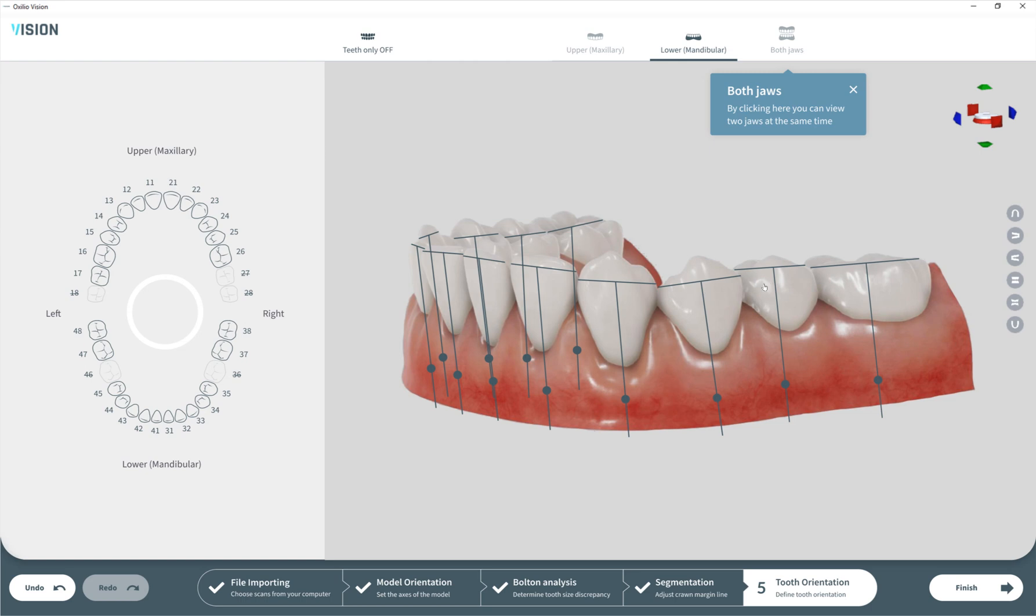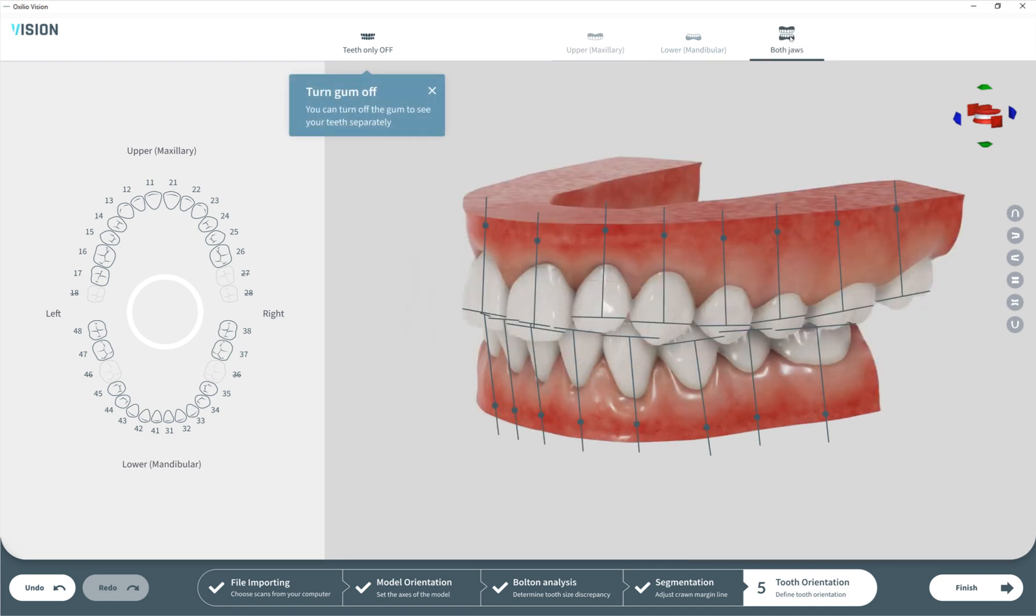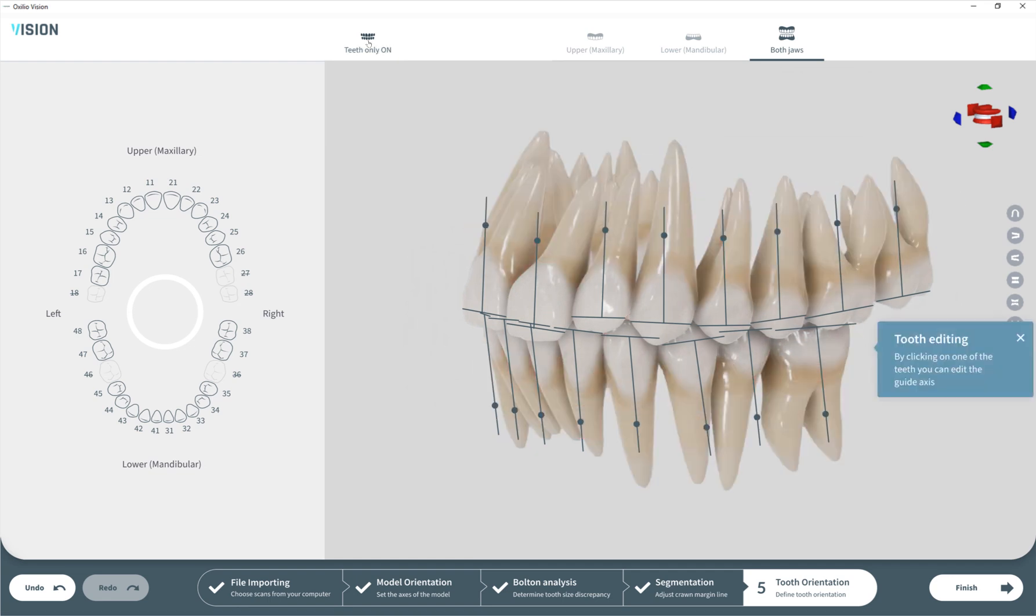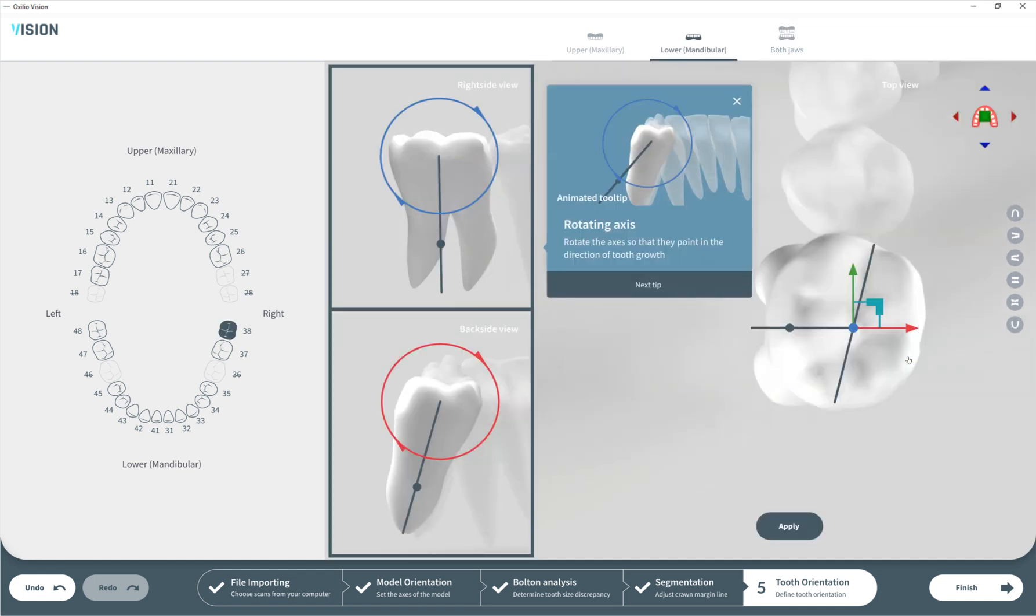Now in this final step we're dealing with orientation. Here we have axes and centers of resistance and we can edit them. From here we can look at both jaws. We can turn off the gingiva and see the teeth with roots. We can go to the editing mode where for every tooth we can correct the axis. Please note you don't see gingiva here, only teeth. The teeth that are not active are semi-transparent so they will not be in front of your tooth in this view.